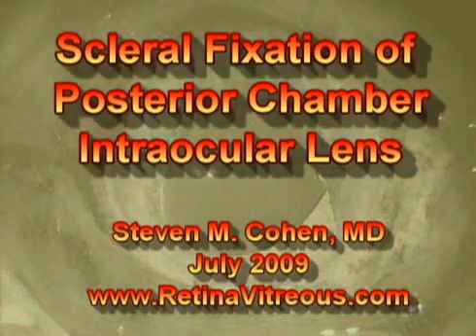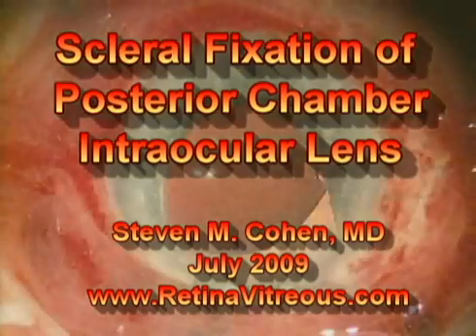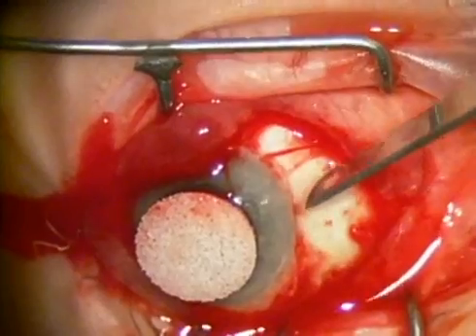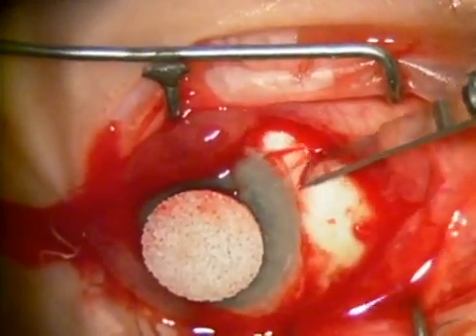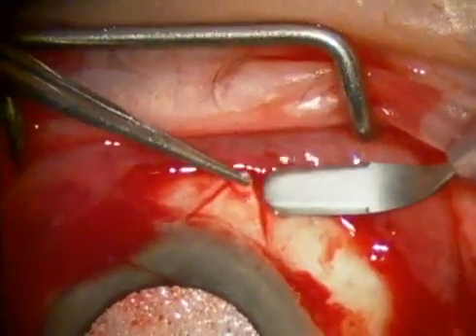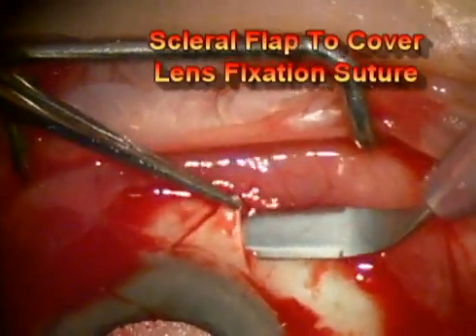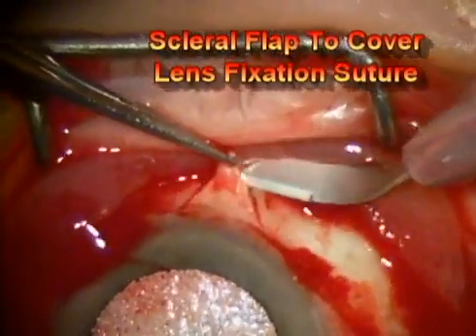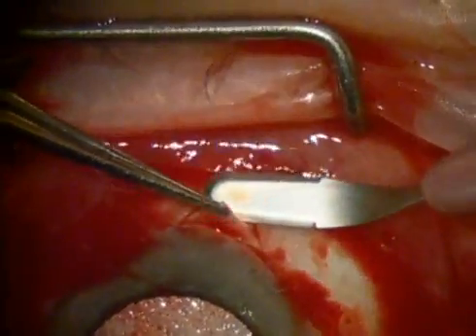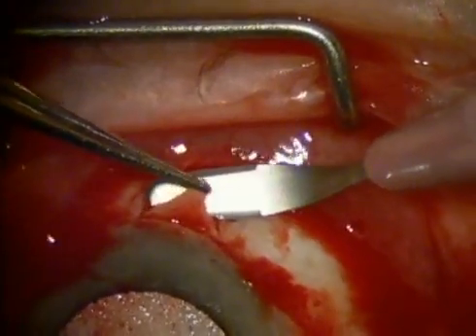Hello, this is Dr. Stephen Cohen, and this video shows scleral fixation of a posterior chamber intraocular lens. At this juncture in the surgery, the surface of the eye has been opened and some cautery has been applied. Here you're seeing a triangular-shaped scleral flap being dissected. This will be used to cover the trans-scleral suture, which will be used to fixate the posterior chamber intraocular lens.